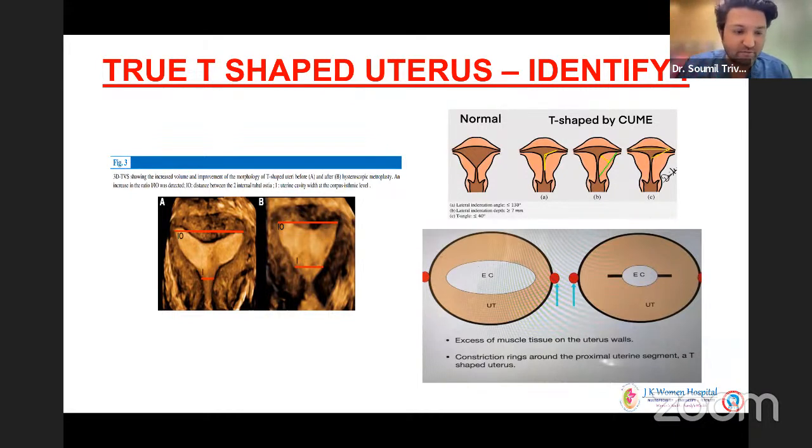I personally agree to that. A small point in this: giving the patient a very good lithotomy and having those Allen stirrups helps so that you have that extra space. Stirrups for hysteroscopy do not make any difference, Amrita. She is saying just to give a good lithotomy so that you have that extra space to go on the lateral wall. Sometimes it is a tricky one to dig into one side.